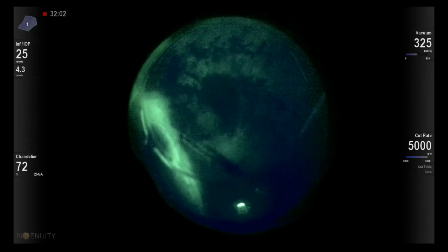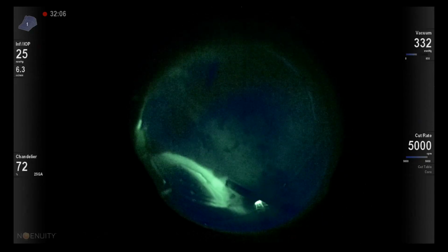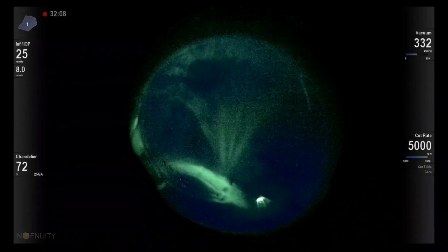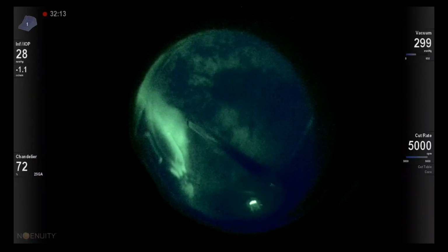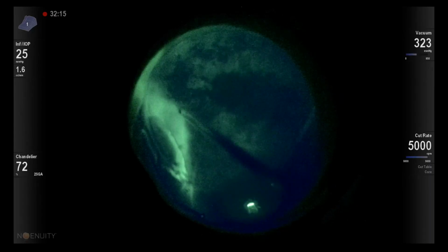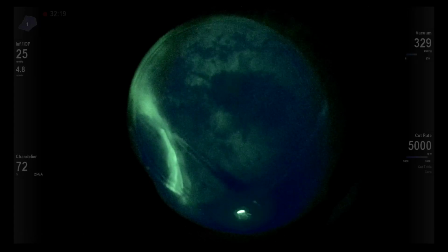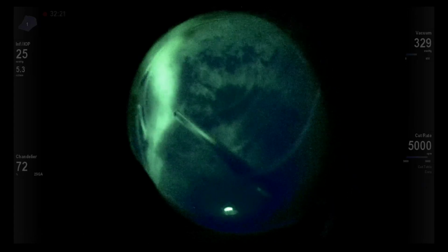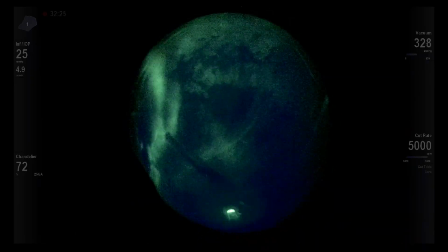We need to think outside the box, and we need to learn new ways to visualize the structures in the eye. As you see here, with the applied filter and method of visualization, I see much more vitreous and ocular structures which are of interest for me at the moment compared to my regular analog view.